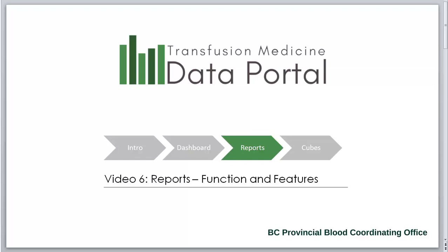Welcome to the Transfusion Medicine Data Portal support video series. These videos have been developed to support the British Columbia transfusion medicine staff and stakeholders in accessing and analyzing their transfusion medicine data from BC's Central Transfusion Registry.